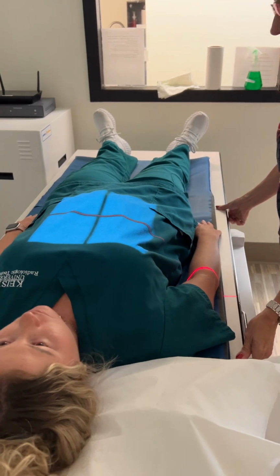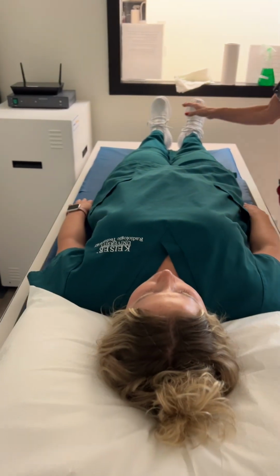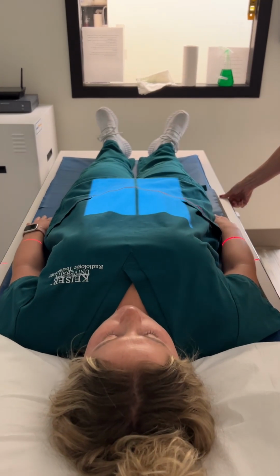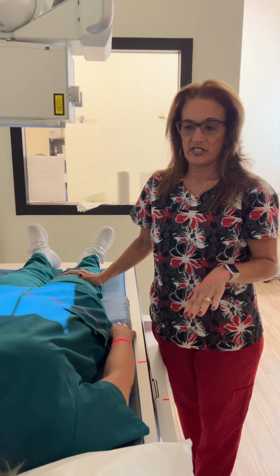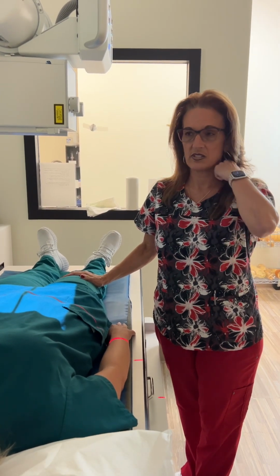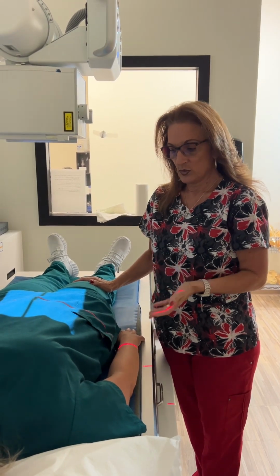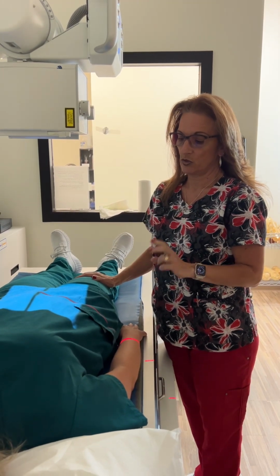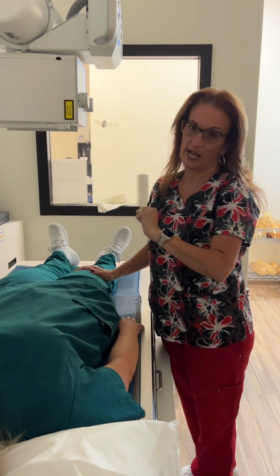And I'm gonna make sure my patient looks straight on there, which she does. You do not have to keep your feet like that. And we're gonna come down. So this bottom image, now according to the registry and according to ARRT, a supine abdomen only has to include pubic symphysis. Nothing is needed as the top border of the diaphragm, but most of the radiologists that we deal with now want both borders, which requires on an adult 2 images, meaning the bottom image will capture pubic symphysis and the top should capture diaphragm.